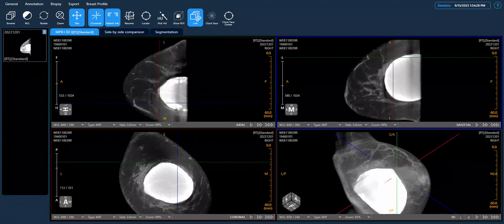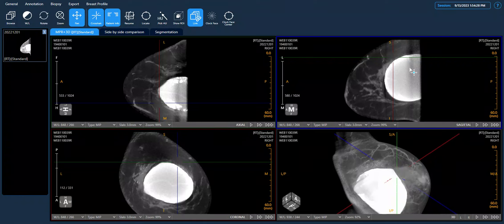Let's review a clinical case involving a 68-year-old woman with breast implants using the ConinViewer. Imaging breast implants with breast CT does not require breast manipulation or any implant displacement. The patient undergoes the same scanning procedure as anyone else, and breast CT provides excellent coverage of the implant.